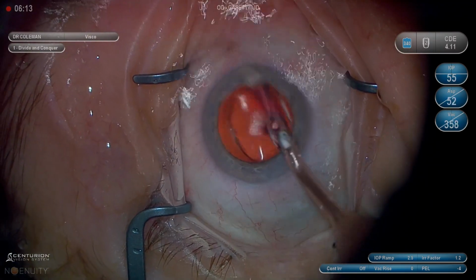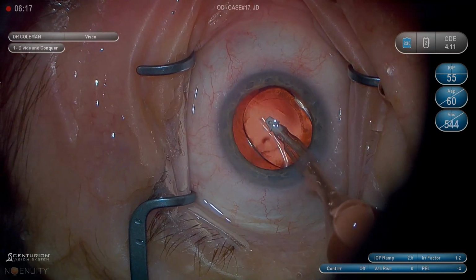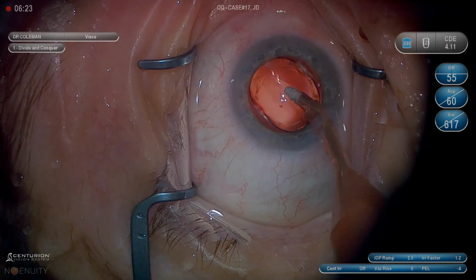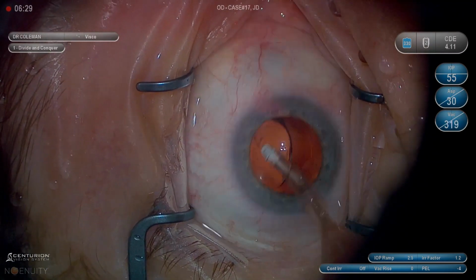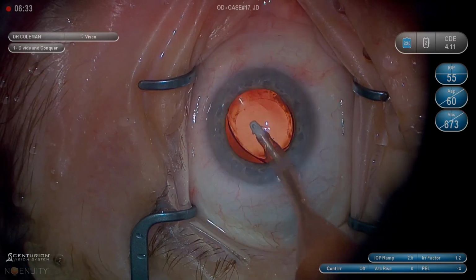My capsular rupture rate in an uncomplicated case is less than 1 per 1,000. So is my partner, Chris Shelby. So I think this technique is efficient, and it's very safe, and it works on 99% of eyes. As I said before, if you can't phaco it using this technique, it's probably time to do SICS. You're not going to be able to phaco it at all.